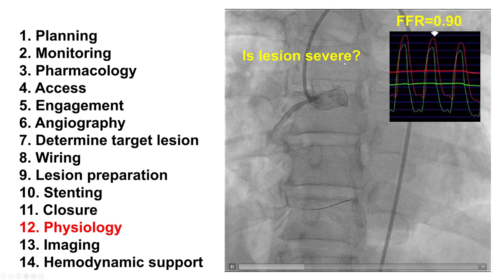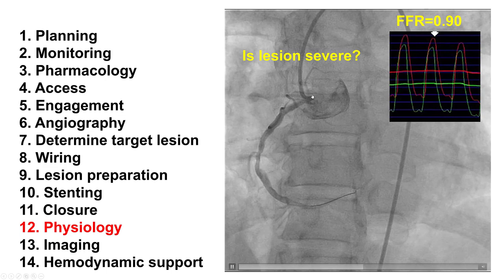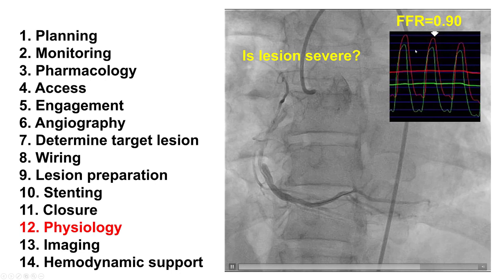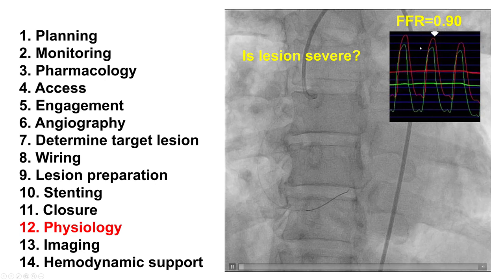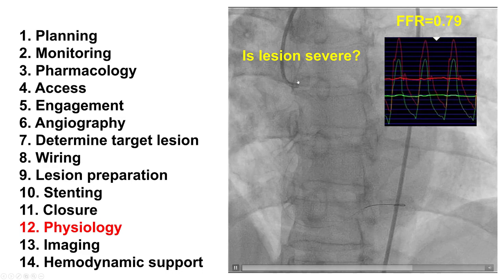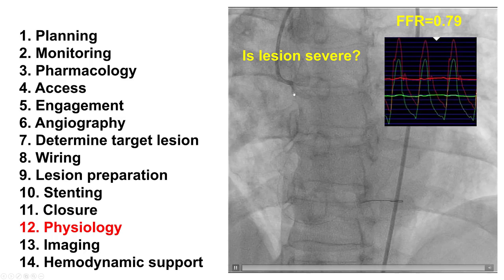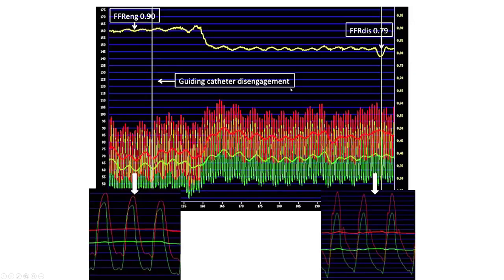Regarding assessing the severity of the lesion, physiology can be done. However, it is very important to ensure there is no dampening of the pressure. This is an example of an osteal RCA lesion: the FFR is 0.9, suggesting it is not significant. However, looking at the waveform, the aortic pressure waveform is dampened. Once the guide is moved back out into the aorta, the aortic waveform looks great and the FFR is actually ischemic. So it is very important when doing FFR or resting indices for physiologic assessment of osteal lesions to ensure the guide is disengaged and there is no pressure dampening.